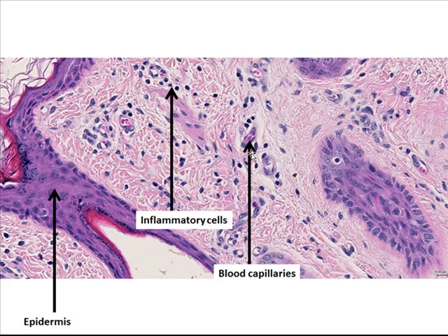Often in a section of skin we don't readily see these capillaries, because if the skin's not inflamed then they tend to be quite quiescent and they're not so easy to pick up. And the other point, you may be able to detect in this section that there's actually a lot more round and oval nuclear type structures around here. These are nuclei of inflammatory cells.